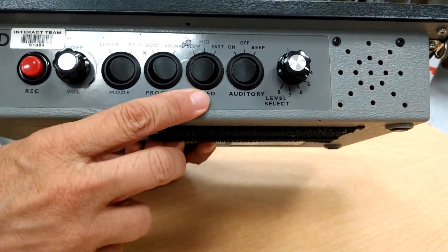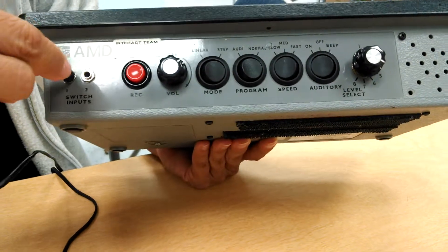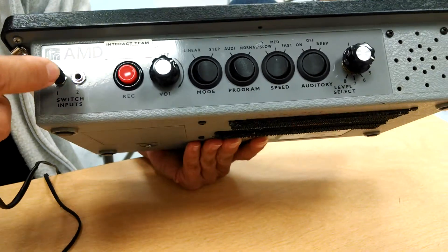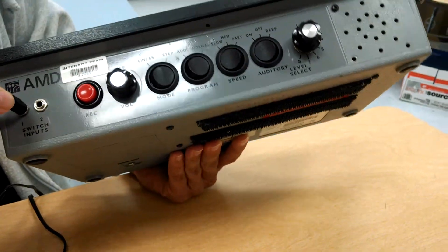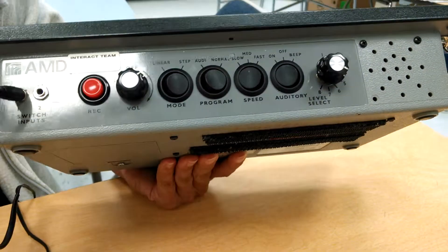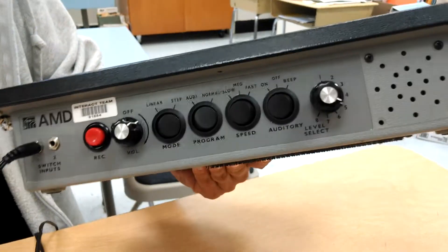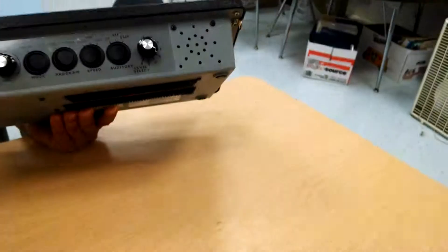So once you've selected your speed — we have slow for this one — then you make sure you have your external switch plugged in to input 1. You want it there because it's for a single switch user; you would use a second one when you're using two switches. That's pretty much it.